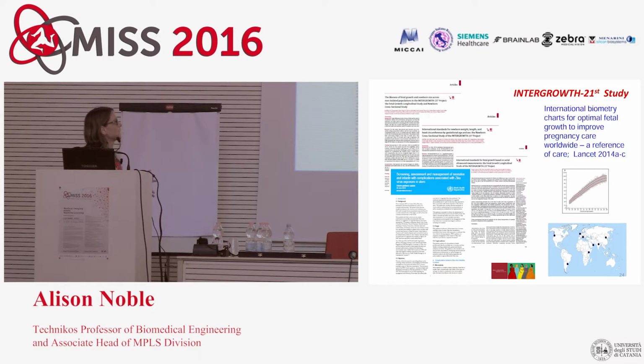What is really special about this is the careful study they've done, the careful characterization around the 5,000 pregnant women. In ultrasound terms, they have taken standard measurements. This is the femur, as shown here, the abdominal circumference and the head circumference. These are the basic measures that people use every day to assess pregnancy around the world.